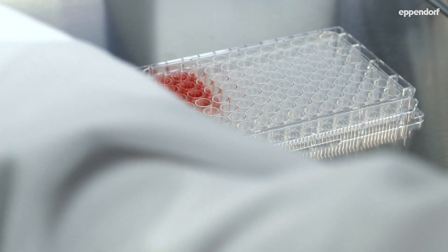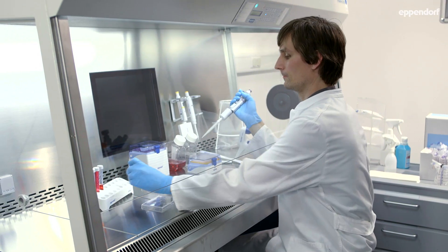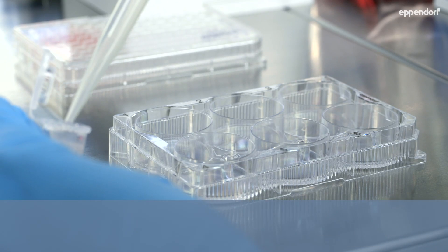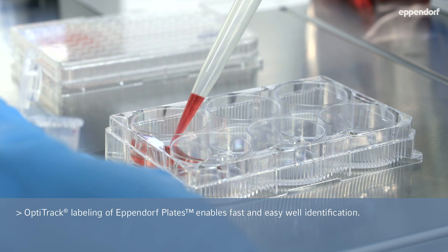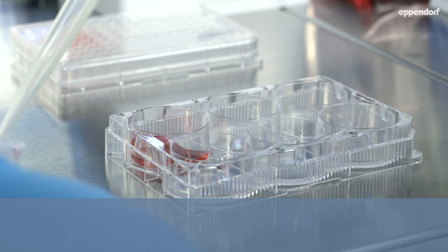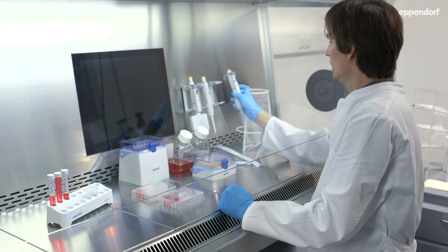All Eppendorf cell culture plates have a high contrast alphanumeric labelling for fast and easy well identification. A defined corrugated gripping area guarantees safe handling.